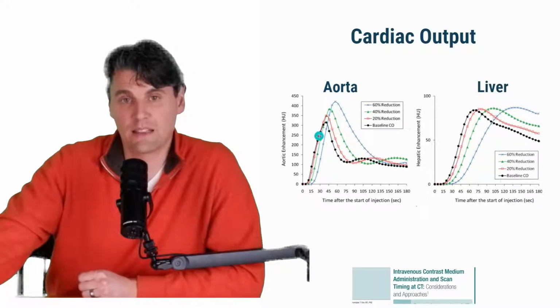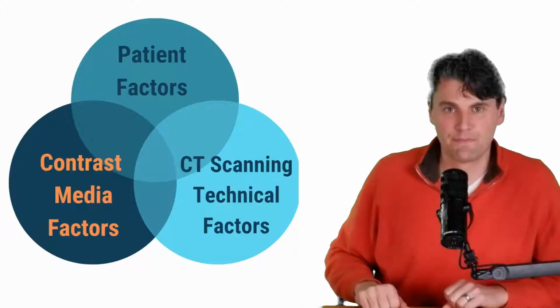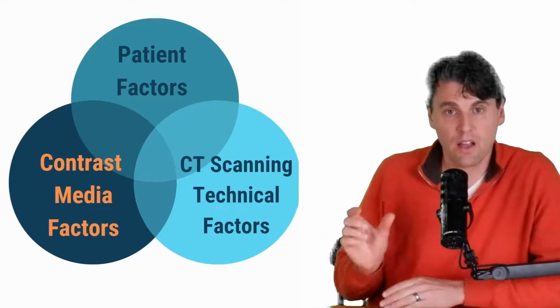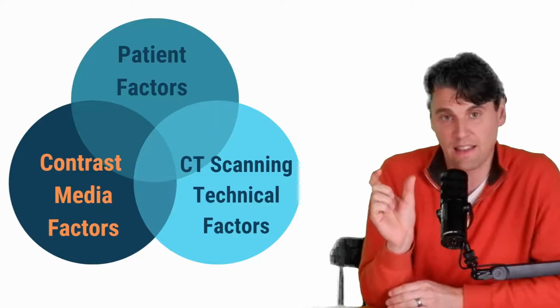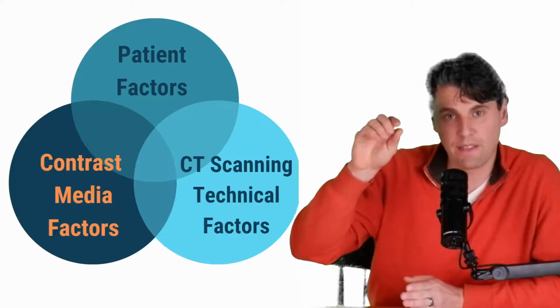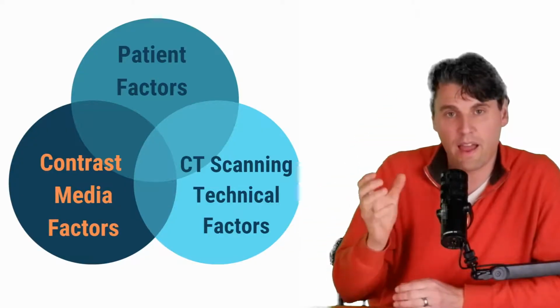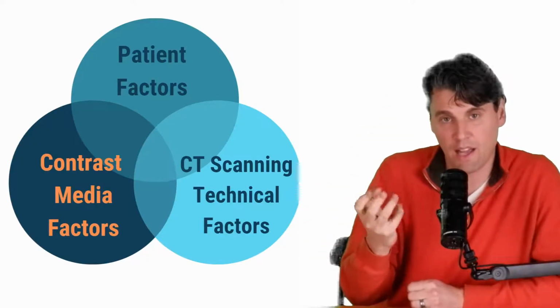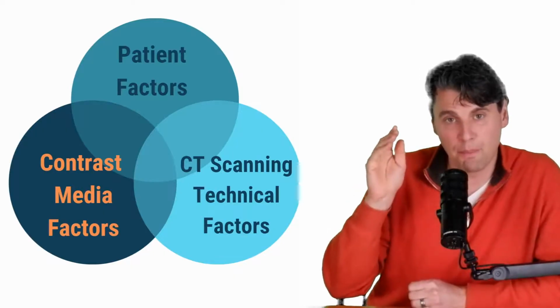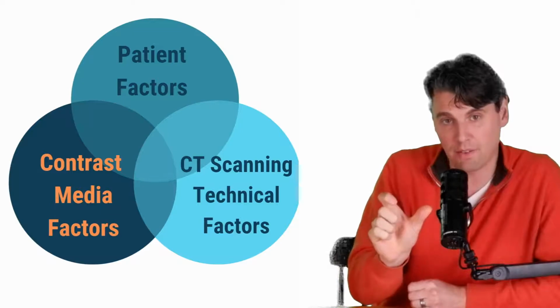It's also going to lead to a higher magnitude in the aorta, but relatively similar magnitude for the contrast level by the time it gets to the liver. So now we've hit the patient factors and that cardiac output factor. Because there is a significant delay that can happen, that's why we do that contrast tracking to see when the contrast arrives. So changes that have to do with cardiac output can be modeled to the first order by doing those measurements of the arrival time on the scan.